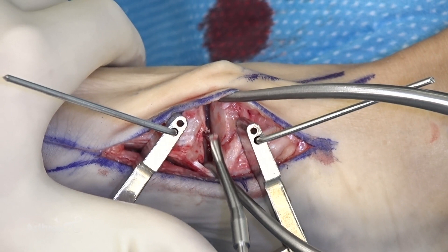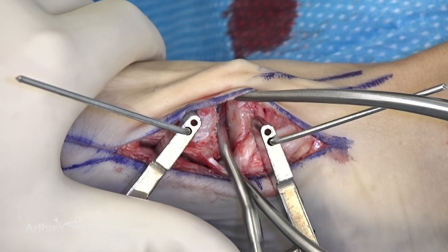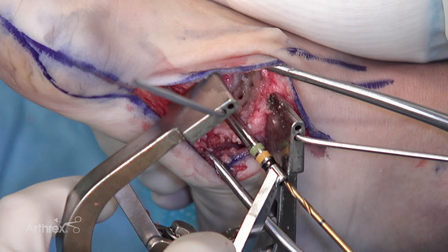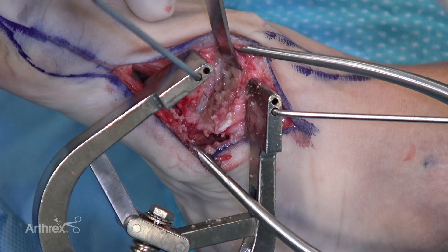Now use the power rasp to snow-shovel the articular surface off — a quick way to remove that articular cartilage. This gets great access to the plantar side of the joint. I'll also take the rasp and feather down the lateral side of the cuneiform. This helps with the reduction as you reduce the intermetatarsal angle. It's important to prep the joint adequately — the last thing we want is a non-union. This brings in some bone and allows channels for bony ingrowth by breaking up the subchondral bone. Then we'll use a little osteotome to fish-scale this as well.